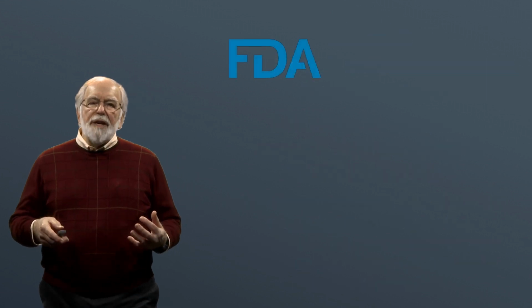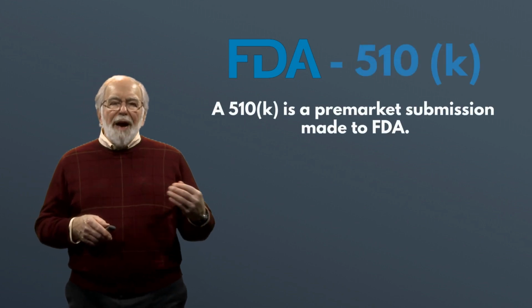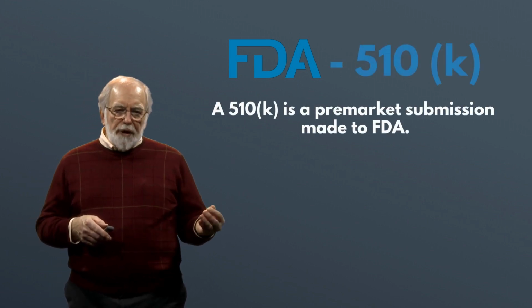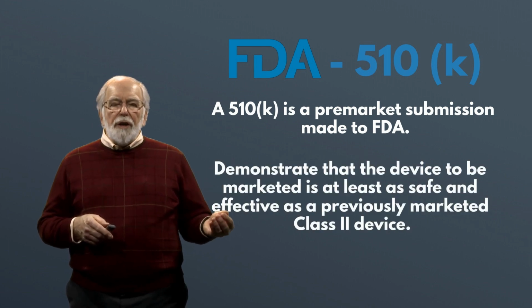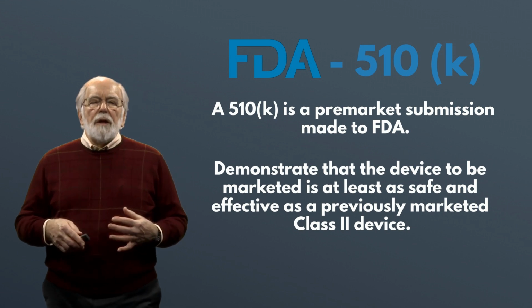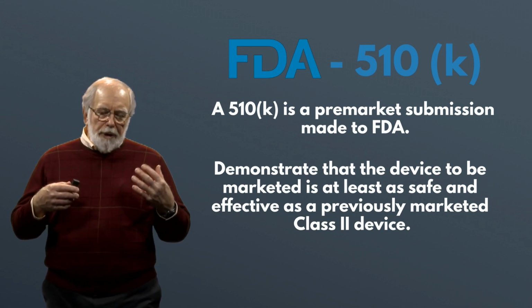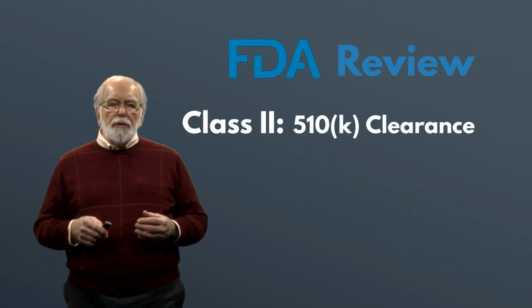How does the FDA regulate approval? Well, with the 510(k) clearance process, which is demonstrating safety and efficacy relative to a predicate device, the applicant merely needs to submit the 510(k) clearance for approval.